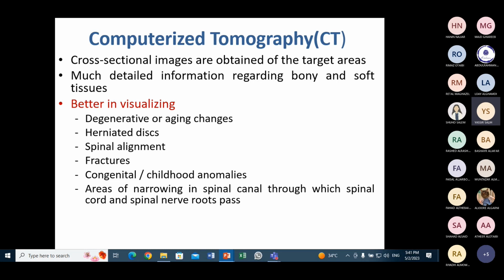ليش؟ لأنه ال X spine, all of you know that spine هو complex ذاته شنو؟ anatomical complex structure، يعني فيه many parts: spinous process, transverse process, lamina, pedicles. وهو complex، فلذلك X-ray usually misses many fractures in the spine, but CT can demonstrate these fractures in cross-sectional or in reformatted sagittal or coronal or even 3Ds.